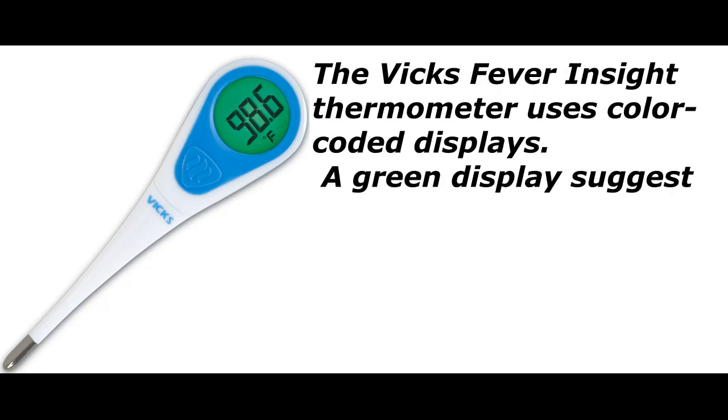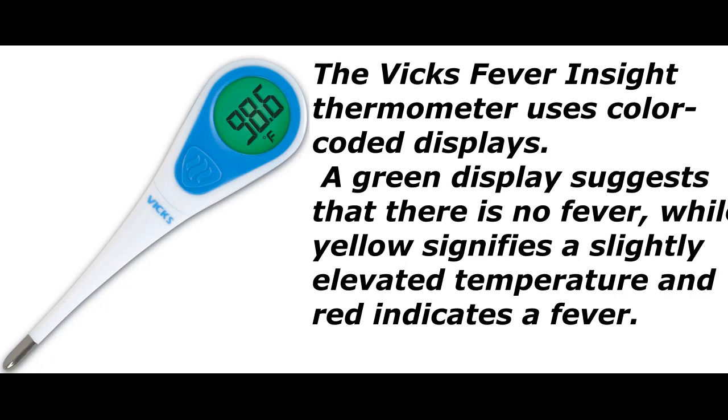The Vicks Fever Insight Thermometer uses color-coded displays. The green display suggests that there is no fever, while yellow signifies a slightly elevated temperature and red indicates a fever.